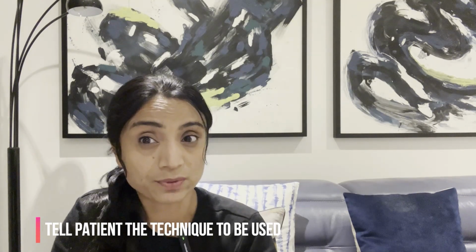The examiner doesn't mind which one you use as long as you use it correctly, but the tidal breathing method is used a lot more frequently, so I'm going to show you that one today. So you need to tell your patient clearly which method you're using. So if I'm using the tidal breathing method, the multiple breath technique, I will just tell my patient, I will not be asking you to hold the breath today.